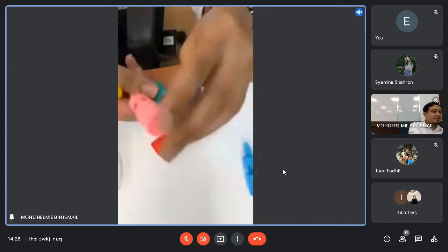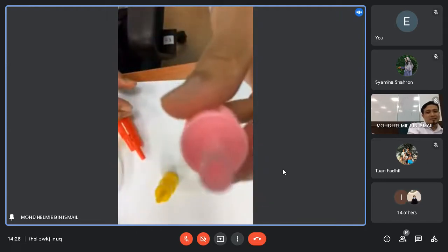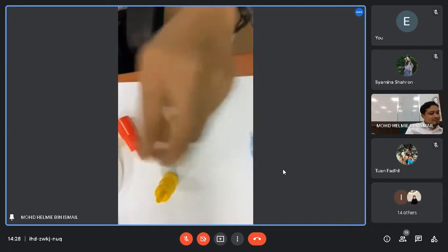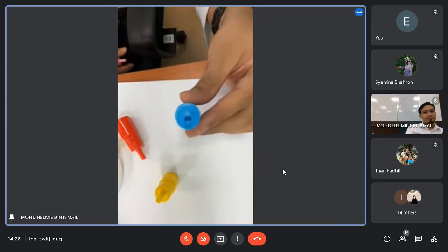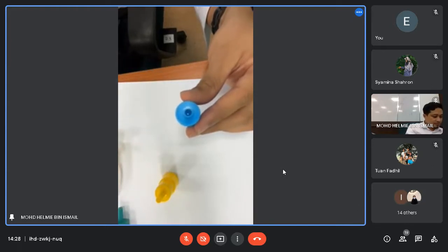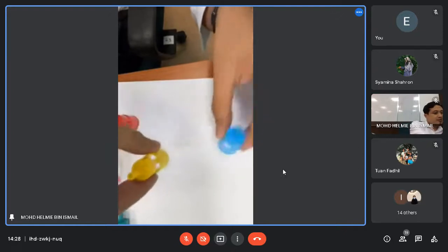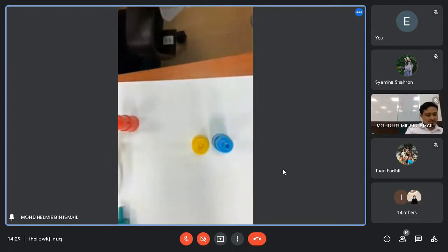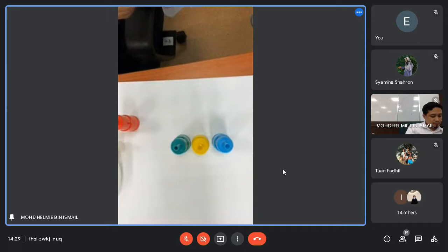Remember? If you are here, you will look here. You can't see it, right? No, you really can't see it. Here it is written that blue is the lowest, 24%. Blue the lowest, and then we have 28%, 35%, 40%, and then this one is 60%. Alright.